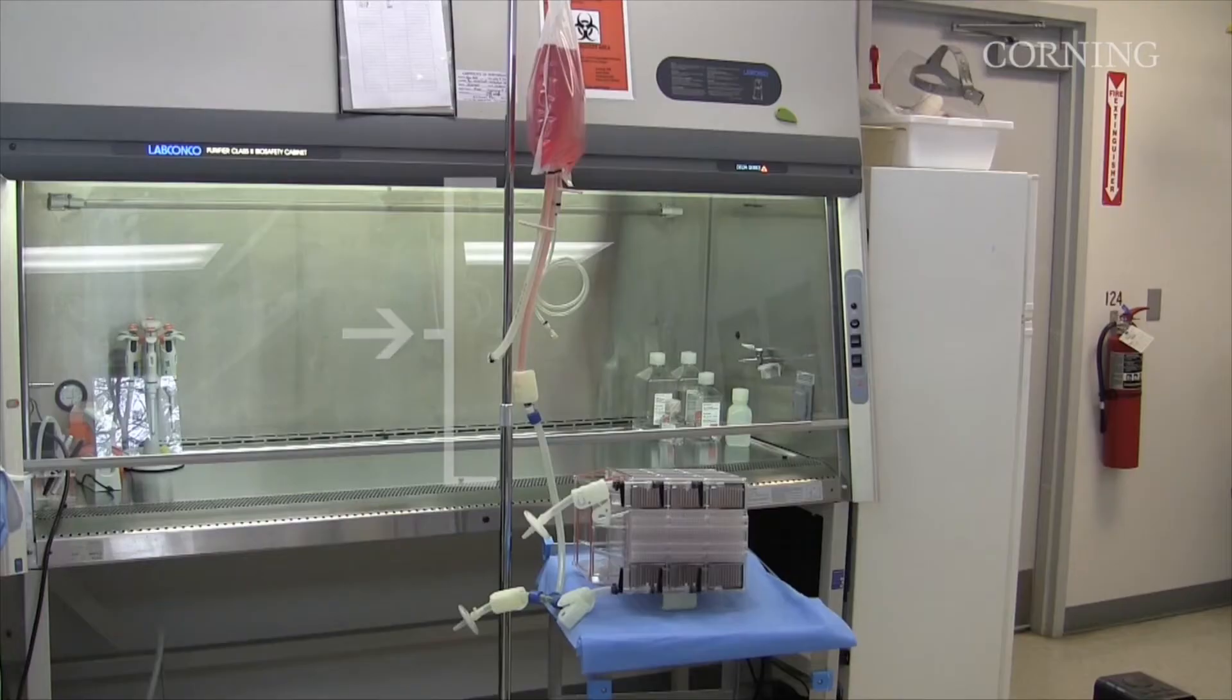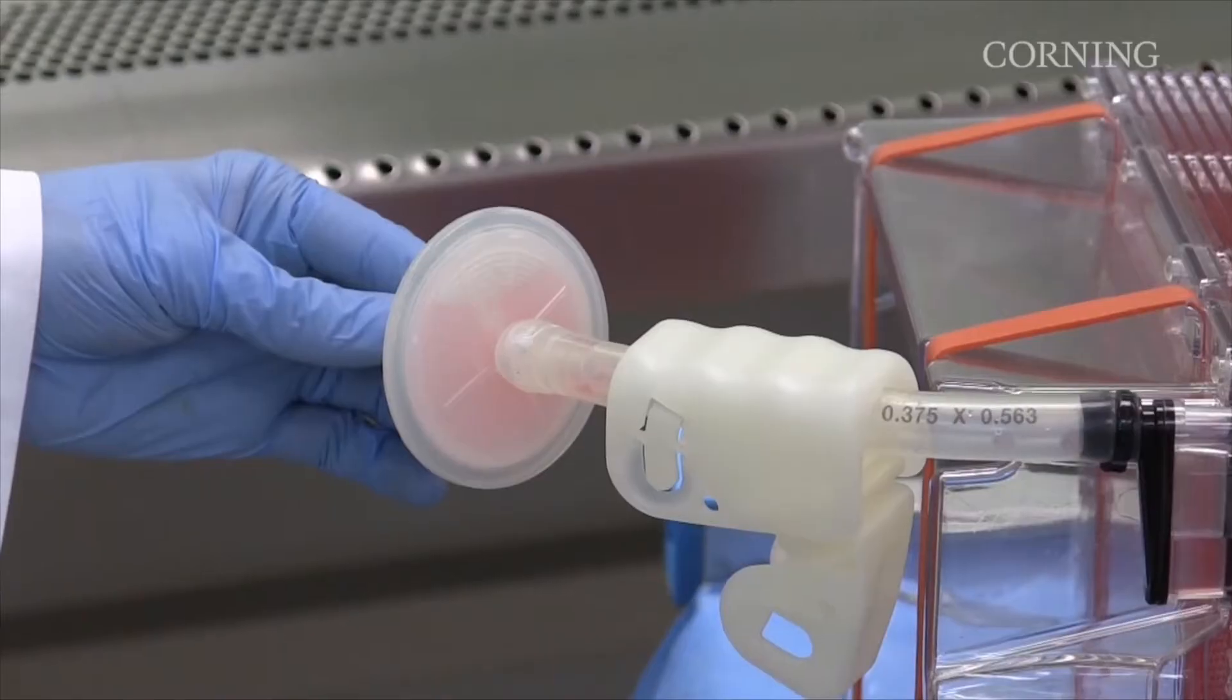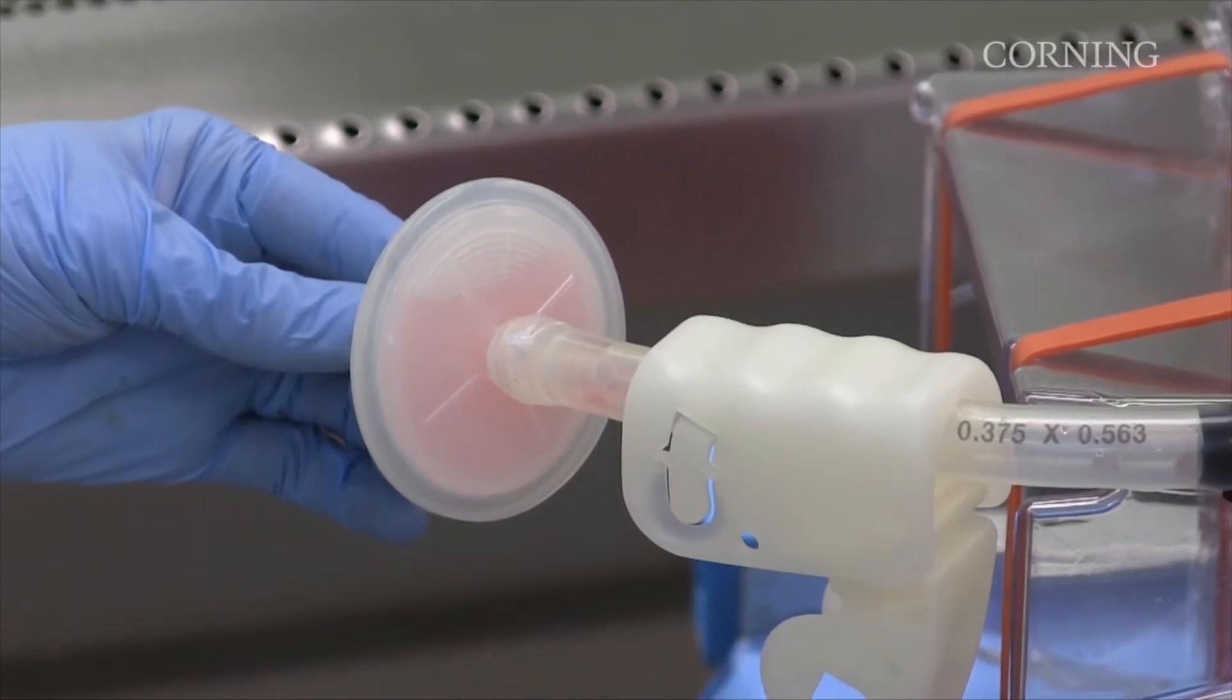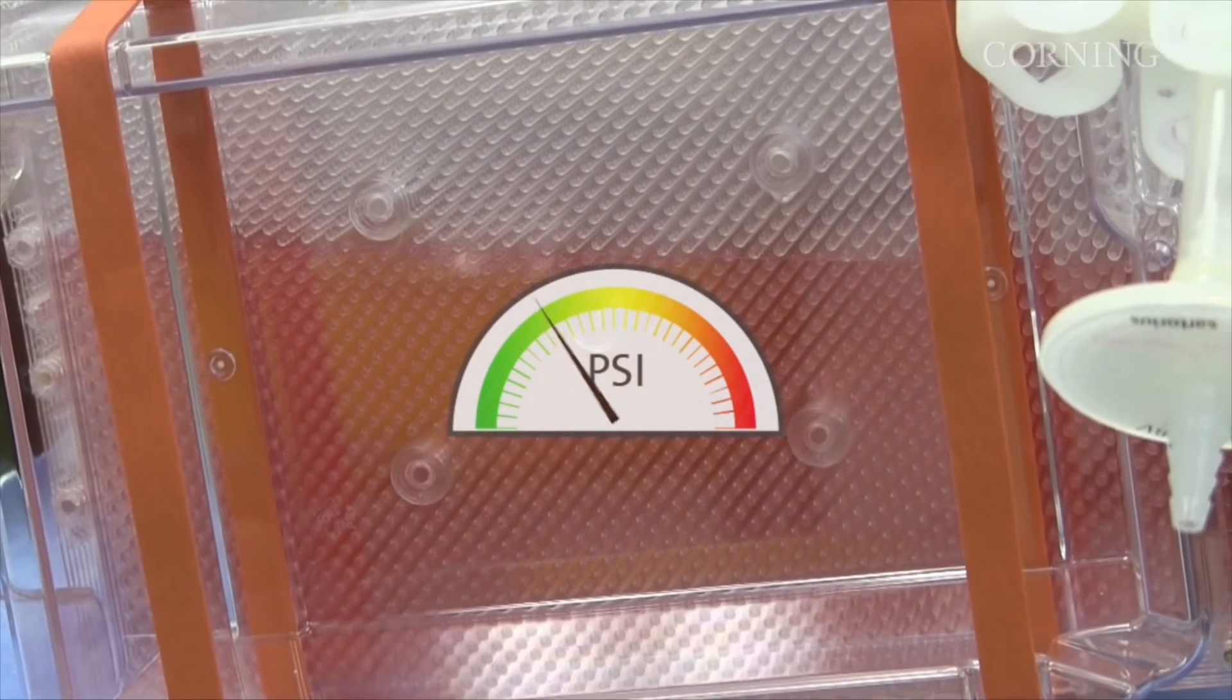To prevent the vent filter from wetting out, be careful not to raise the source vessel too high, which will fill the vessel too quickly. A wet filter prevents air from leaving the HyperStack vessel, which pressurizes the vessel and increases the risk of vessel failure.